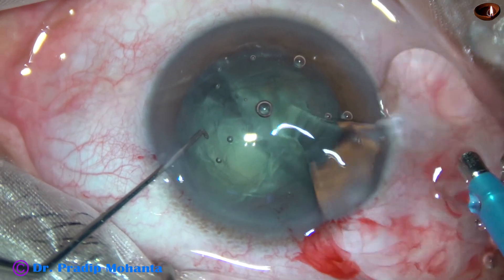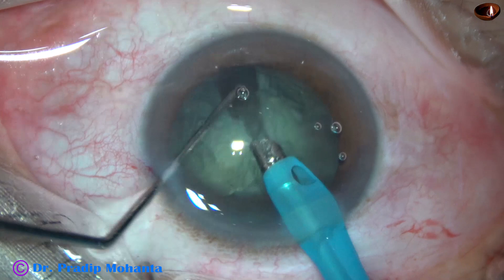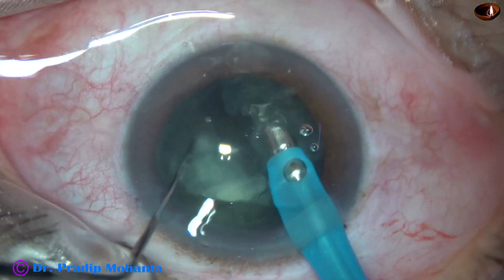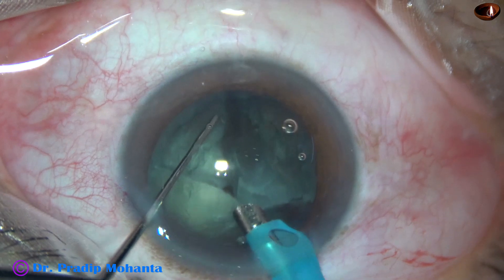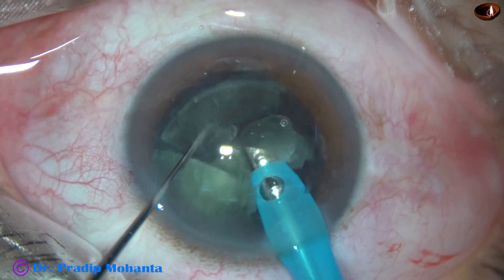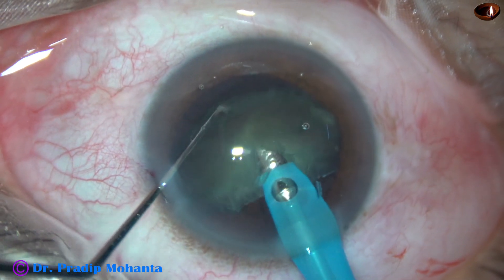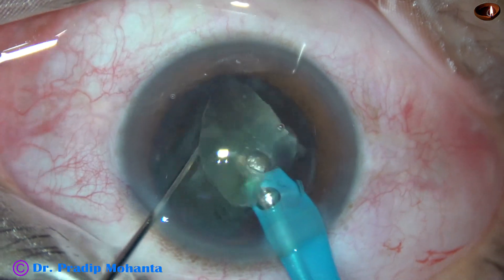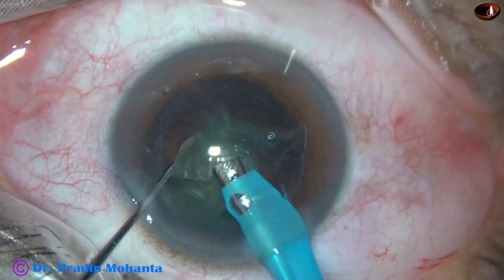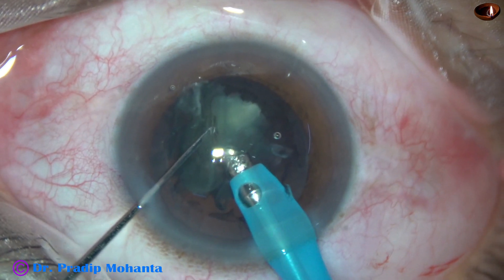And now the management of the nucleus is going to be very simple. I am removing some superficial cortical lens matter and just dividing one hemi-nucleus into two pieces. The bevel is sideways. And the other hemi-nucleus is also divided into another two pieces. In a few seconds the pieces are emulsified, and this is the last nuclear fragment.